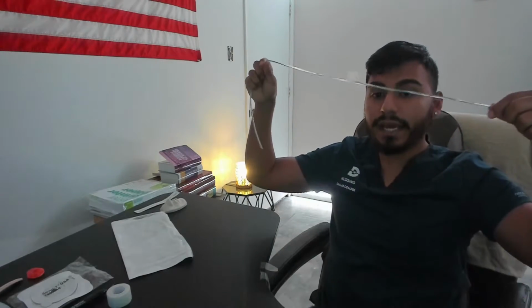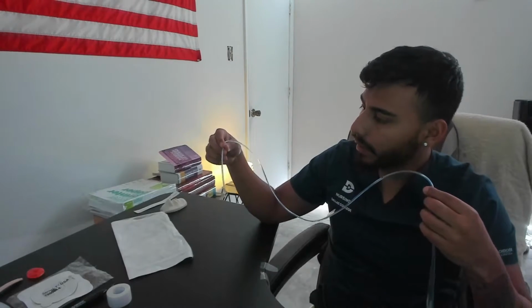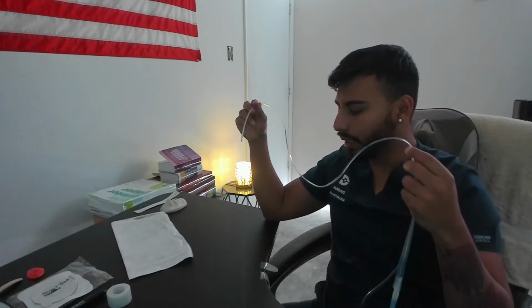So once I have it marked, I want to dip my tube into some warm water and lubricate 4 inches of the tube. What I'm going to do is have the patient's neck hyperextended. Once it reaches the nasopharynx, the patient's going to tuck their chin in. I'm going to encourage the patient to swallow.